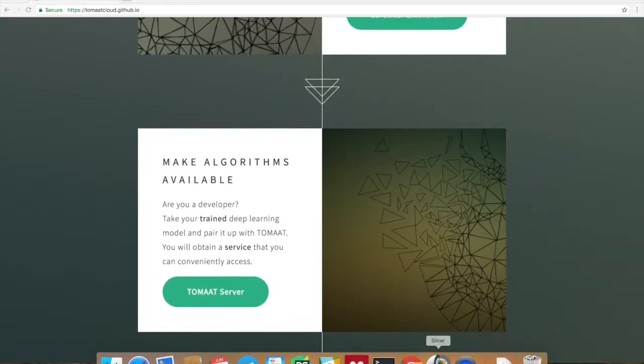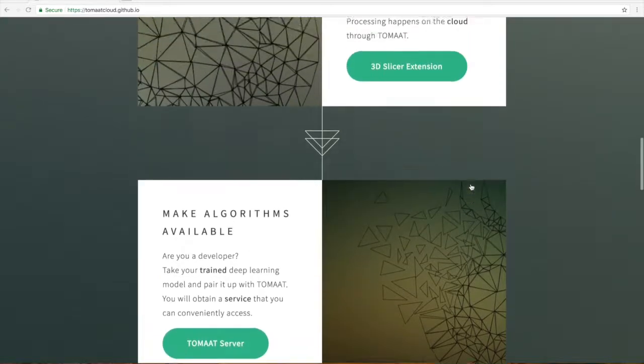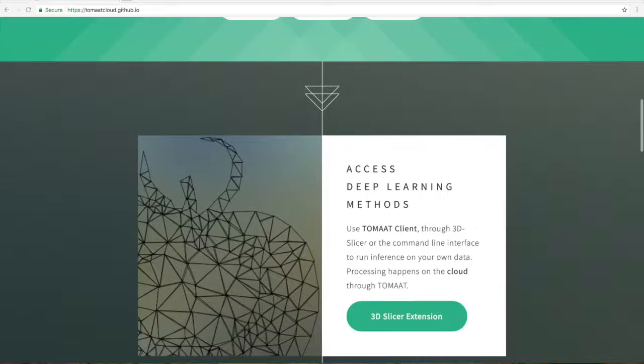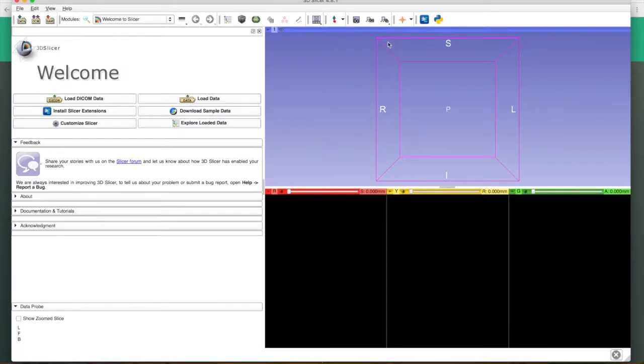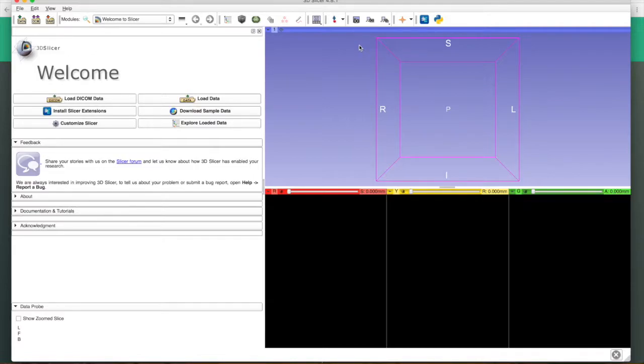We can at this point have a look at the client. The client is realized through 3D Slicer. 3D Slicer is a very popular visualization tool for medical data and is widespread in the research community.